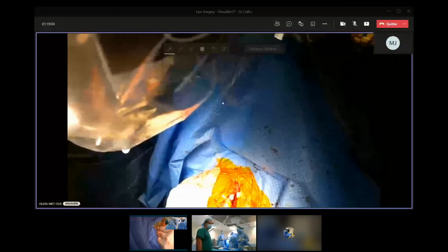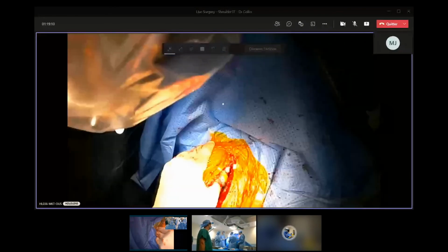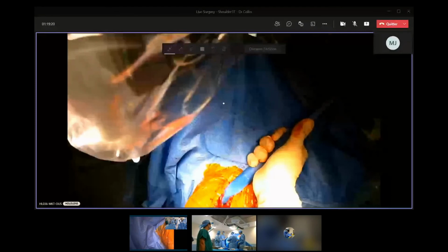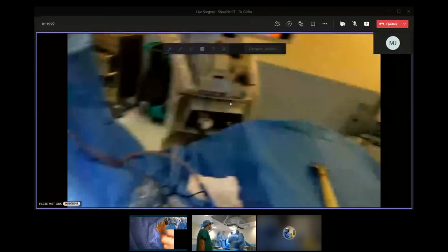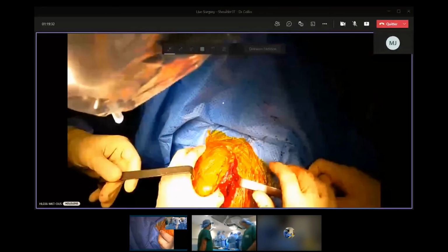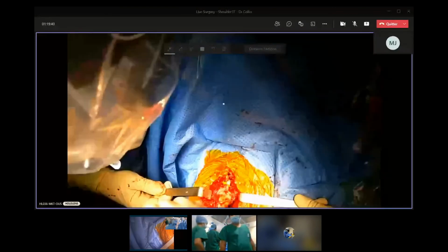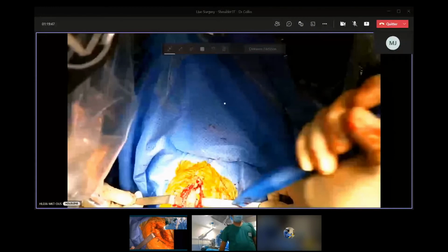Do you check the possibility to repair the subscapularis before? I will at the end, in fact. Here, it's going to be a bit difficult, but we'll see. Because I think it's going to be a bit difficult to reattach the subscap. We can check now if you want, Philippe. Yes, I think check. Far above, please. It's better because we don't need to make holes. Maybe you can do a medialization of the humerus to repair easily. I think it's going to be possible. Look at this. I think it's okay. No problem. So we're going to reattach the subscap.